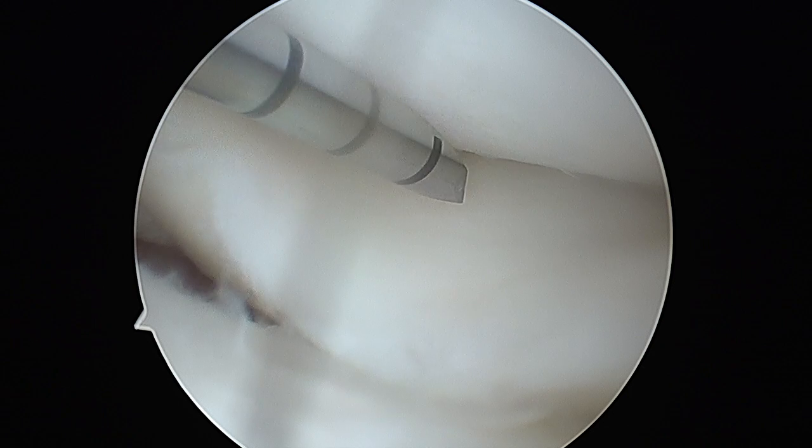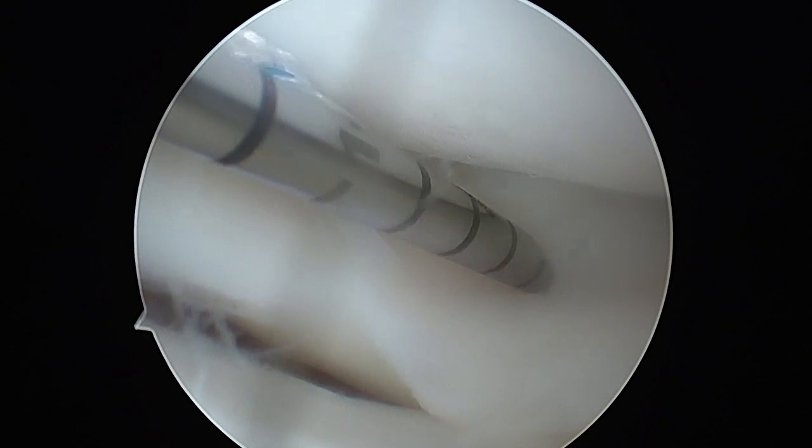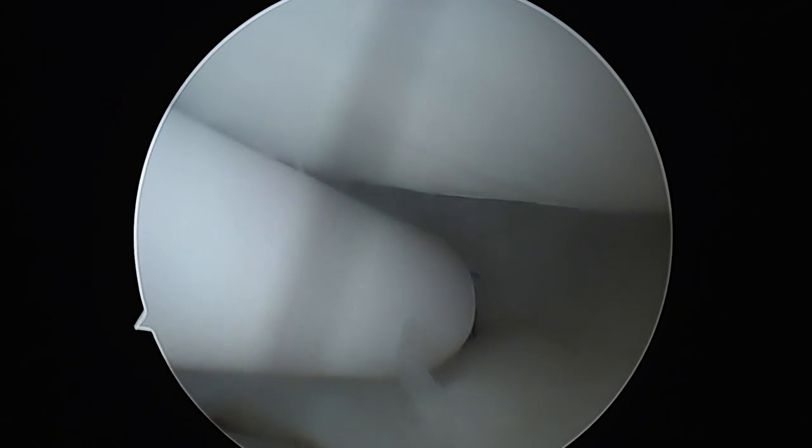The sentinel suture that anchors the meniscus, also known as the first suture, is passed through the posterior horn. The needle is advanced with gentle rotatory movements till the wide part abuts against the meniscus.